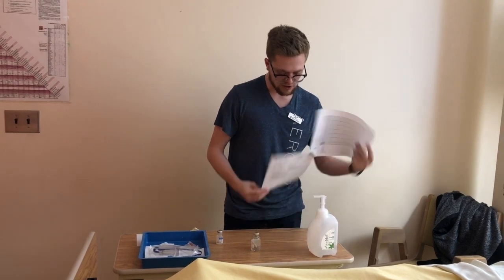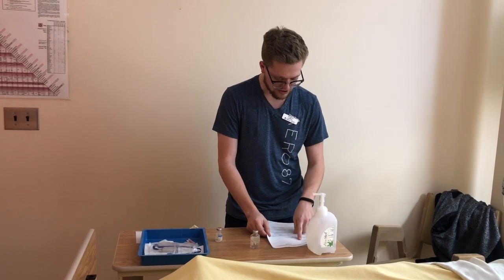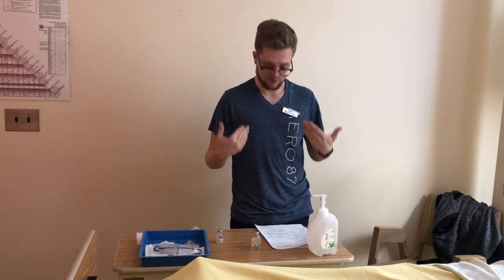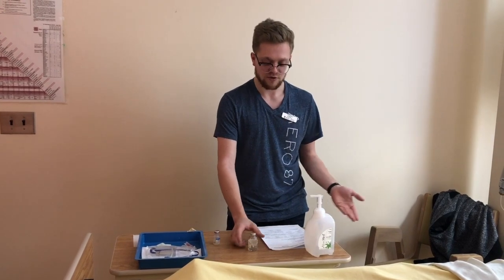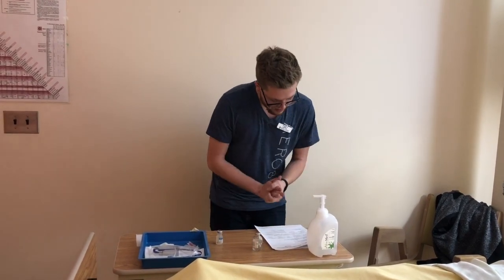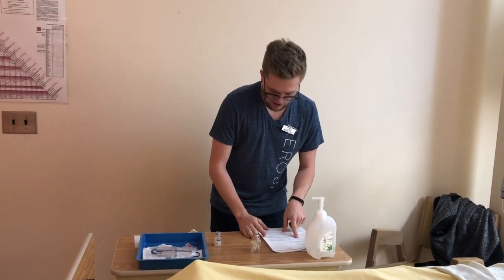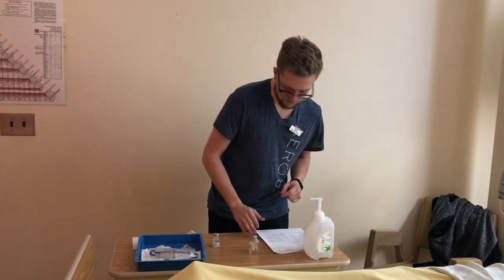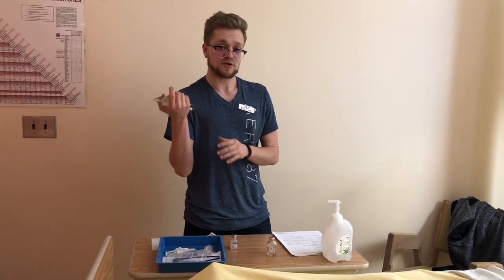Next we're going to move on to the parenteral monograph for cloxacillin. You want to look right away, make sure that a student nurse can give it, and they can, so that means I'm okay. The usual dose is 1 to 2 grams, IV every 4 to 6 hours, so that totally fits with what I have. For the 1 gram ordered dose, we are going to make sure that it is diluted with a 100 milliliter mini bag. So I want to look here, and I have my 100 milliliter mini bag of normal saline.